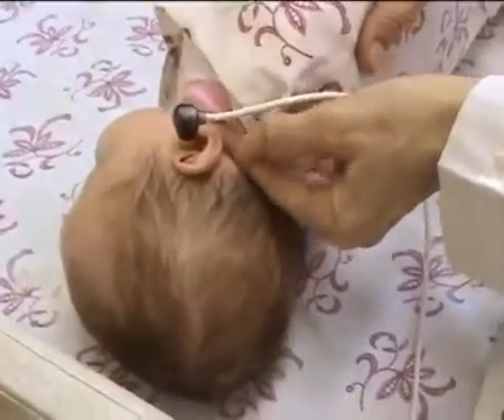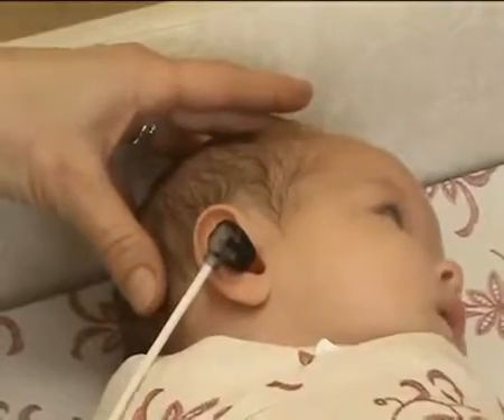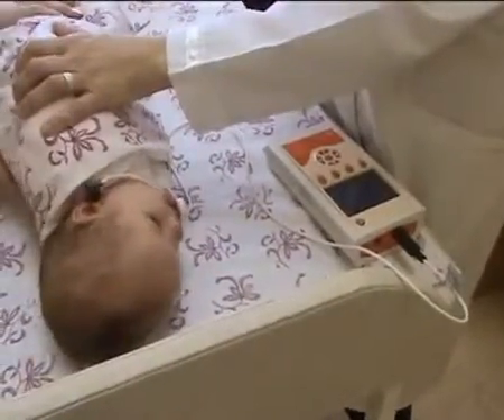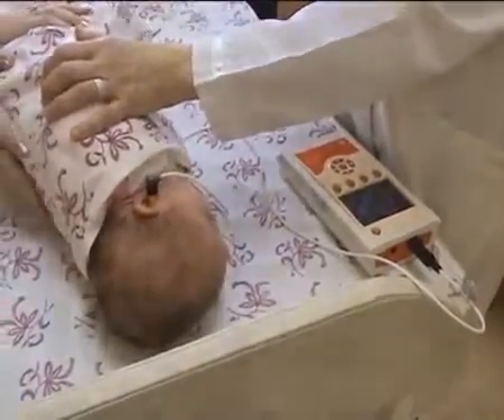Insert gently the probe into the newborn's ear by soft rotational movements. Make sure the probe is at the proper angle. The general rule is the probe should be directed towards the newborn's nose. The newborn may struggle and move while inserting the probe in the ear. This is normal behavior.